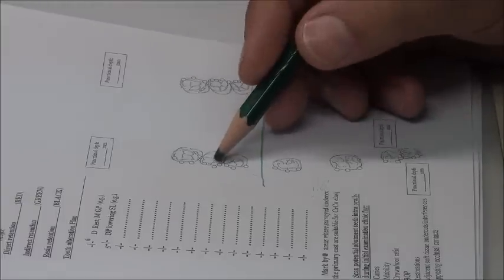Either interproximal, اللي هو double rest on the 7 and 8. Okay, I could use that. That's the best for support and for direct retention. For the extra component I added also for indirect retention. Okay? الكيس اللي بعدها.